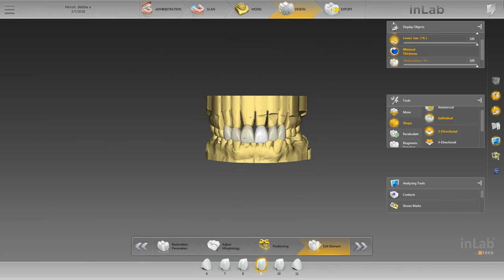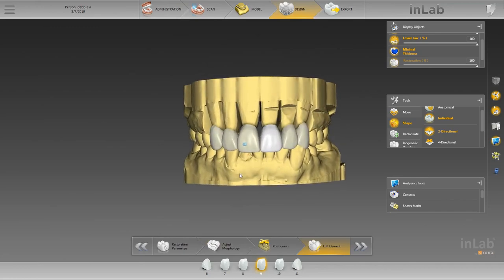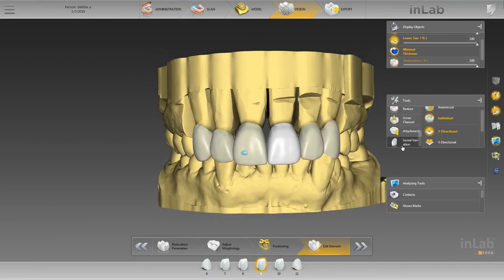Okay, and one last little final touch before we smooth it out is incisal variation. This just adds a little bit extra. With the laterals, I like number 3. It brings the whole tooth back, and you can see it with the dramatic strength. Right here, it's a little lower on the incisal, which I actually kind of like on this case. And then right here, it goes a little bit even lower. Let's try all those out.